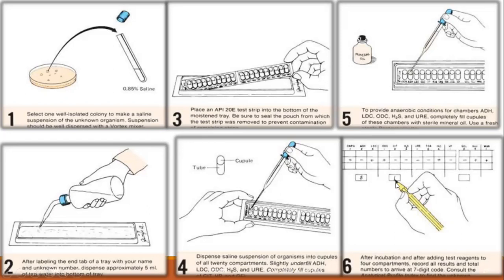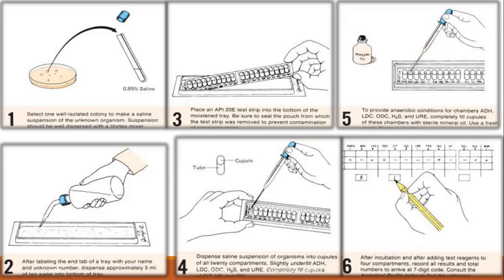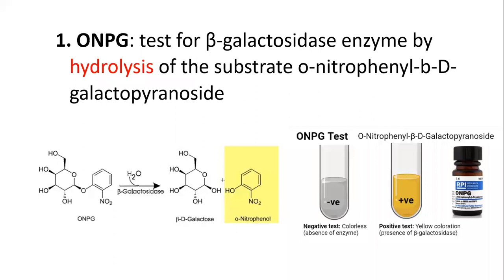I will show you at the last what these 6 points mean. Okay, so this is an easy step. You just have to be a little bit precise and keep those 3 points in your mind. Okay, after that, now we are coming to the tests.